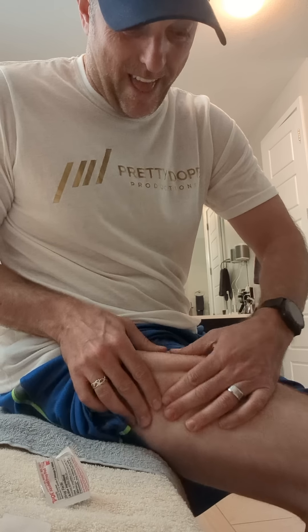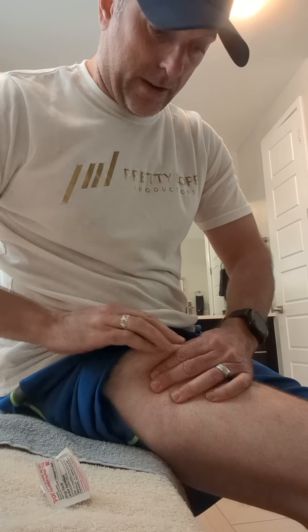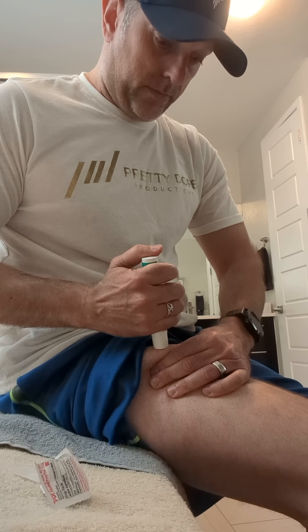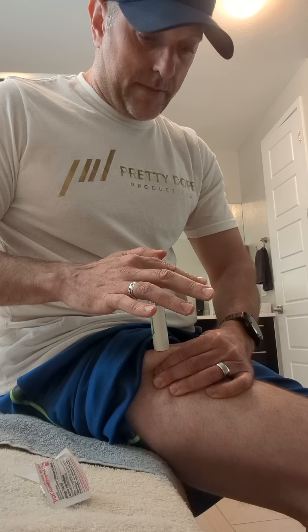So get a good pinch and make sure you don't release it or it's not going to feel good. I got a good grip there, make sure I got that area. One, two, three. It's going to click here. You see the yellow going down? Just not making a click today. One, two, three. Done.